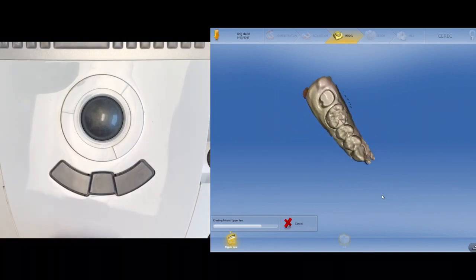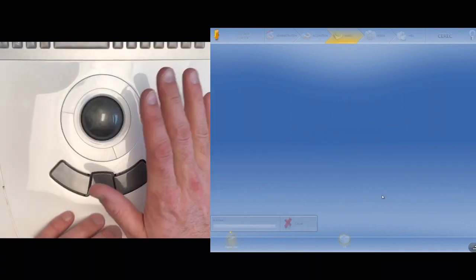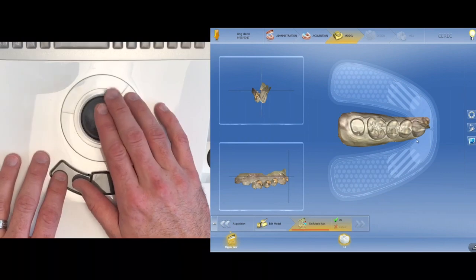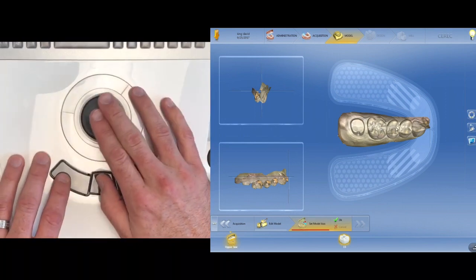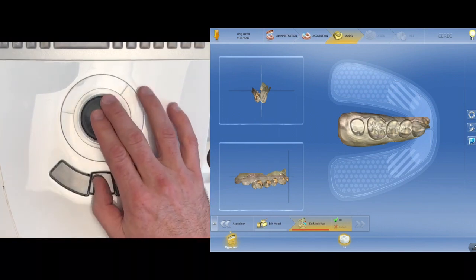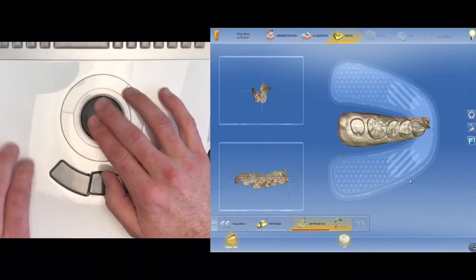So once it's done processing, and realize we only took the upper image, we would have taken a lower and a bite in a perfect world. If this was a biocopy, we'd have the biocopy image and the arch we're restoring image. So remember, this is a rotate button. This is a zoom button, zoom in and out. This is our pan button. In this screen, the zoom button doesn't do anything.